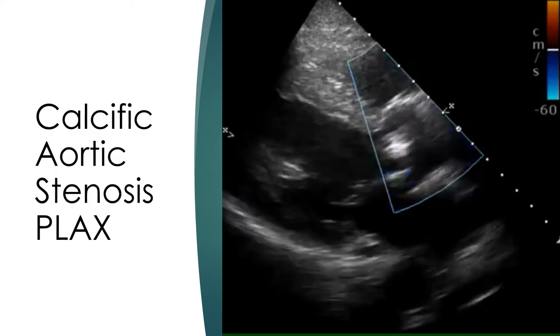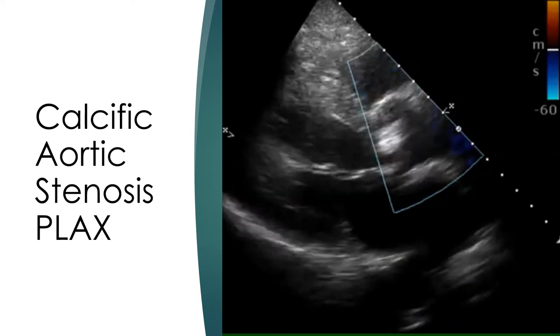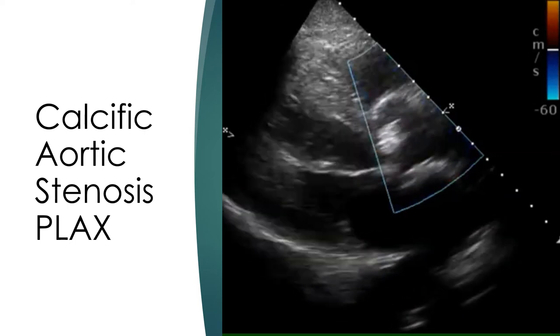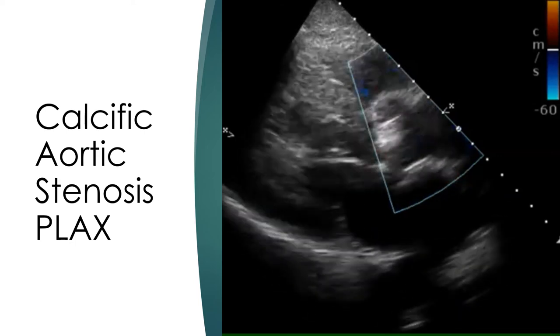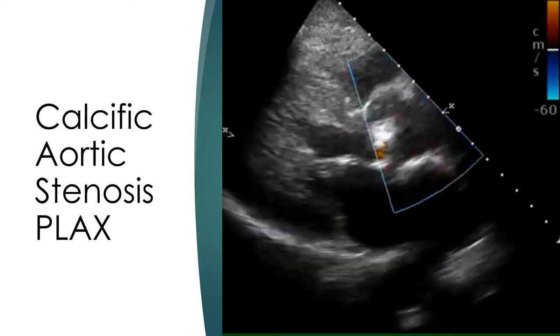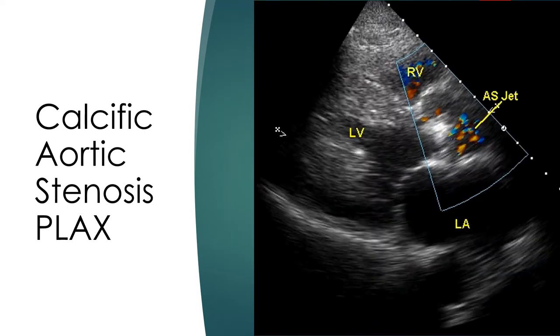Note that the left ventricular cavity is quite small in systole due to hypertrophy. Still image from parasternal long axis view with color Doppler showing the aliased jet beyond the domed and densely calcified aortic valve.